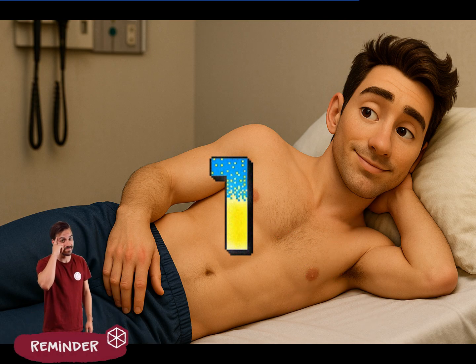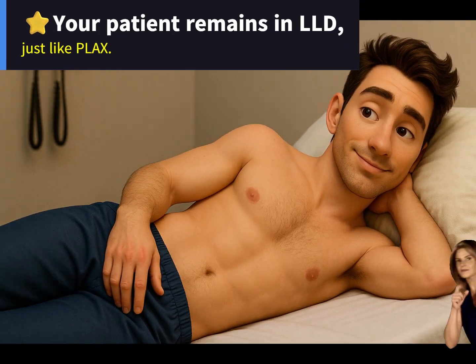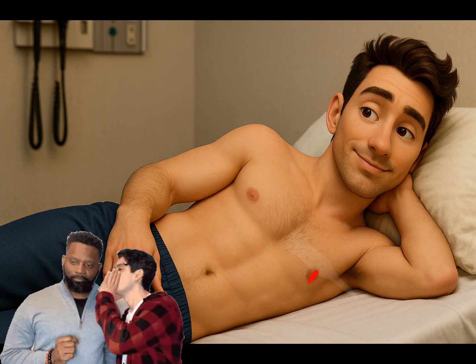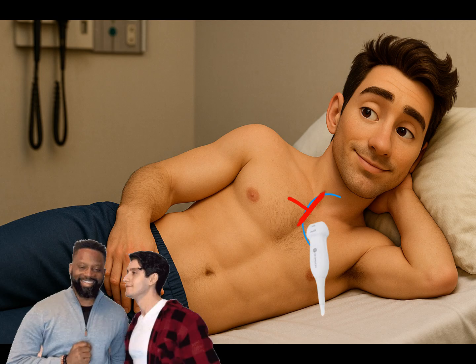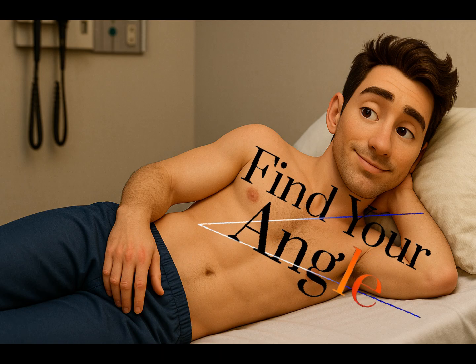Patient position reminder. Your patient remains in left lateral decubitus. The secret to RVIT and RVOT. You do not move the probe. You do not rotate the probe. The only thing you change is the angle.